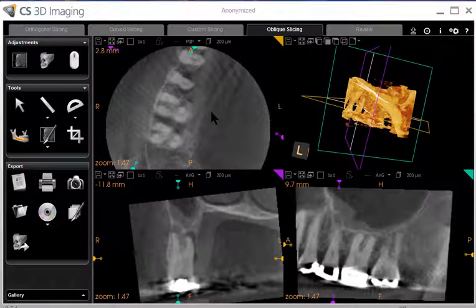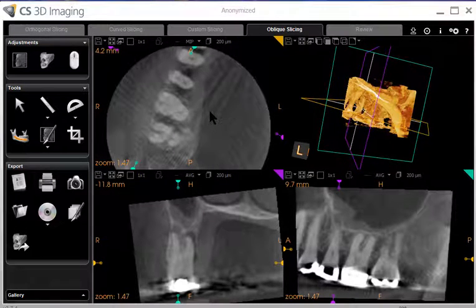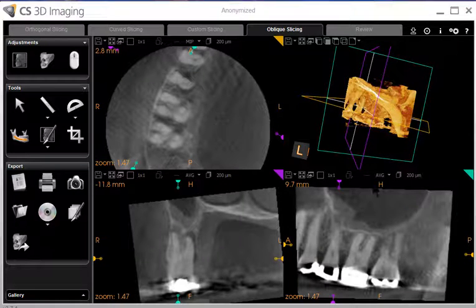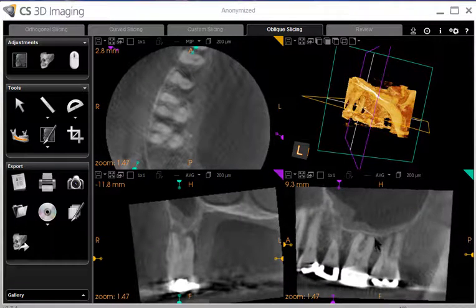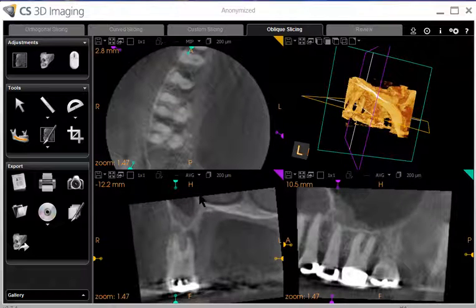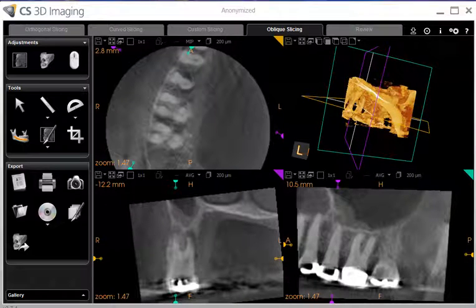People ask: can you see cracks on cone beam CT? The answer is — maybe, depending on the width and the resolution of the cone beam. But instead of looking for the crack itself, I tend to look for a pattern of bone loss consistent with a crack.